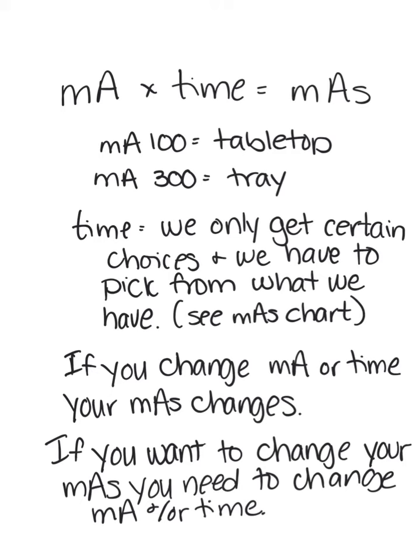So there seems to be additional confusion over how mA and time interact with mAs. So the first thing you want to do is remember the equation: mA times time equals mAs. So if you want to change your mAs, you have to change either your time or your mA.